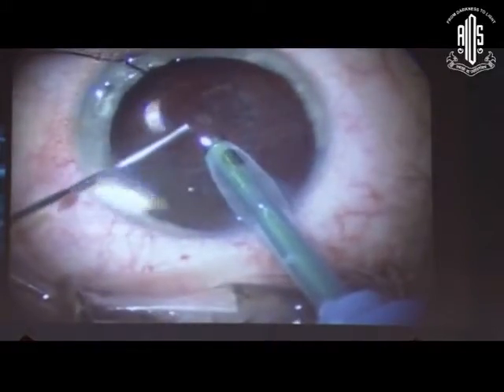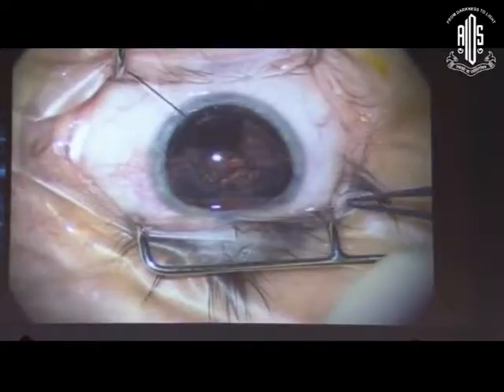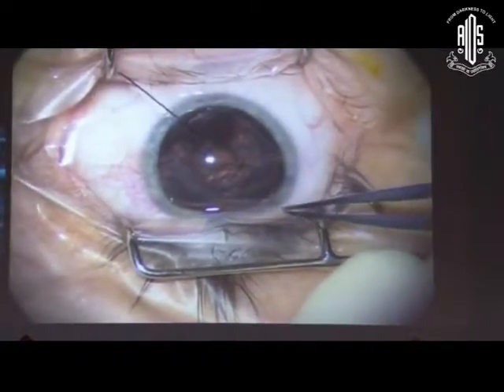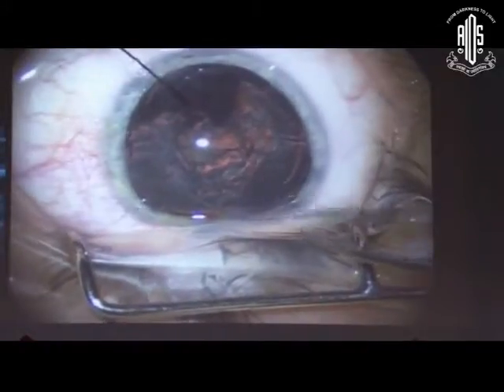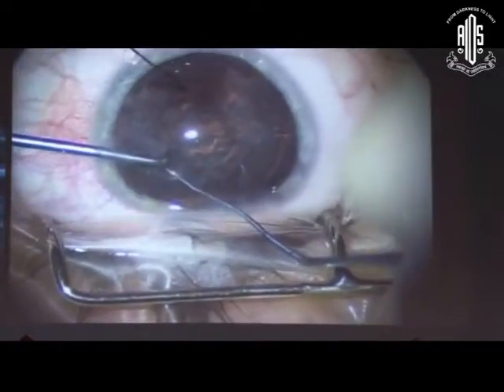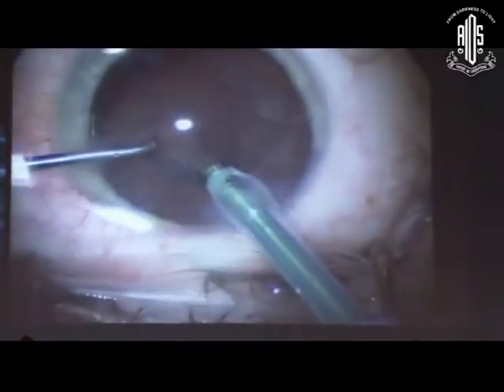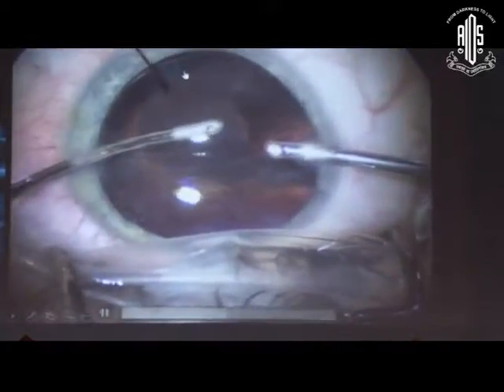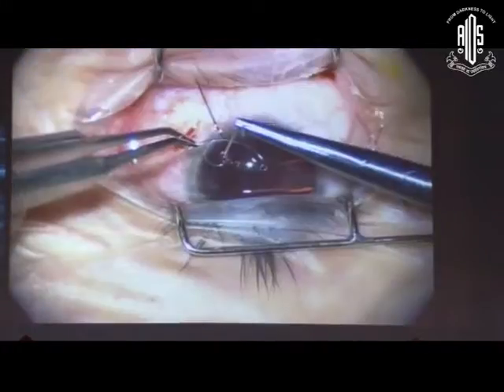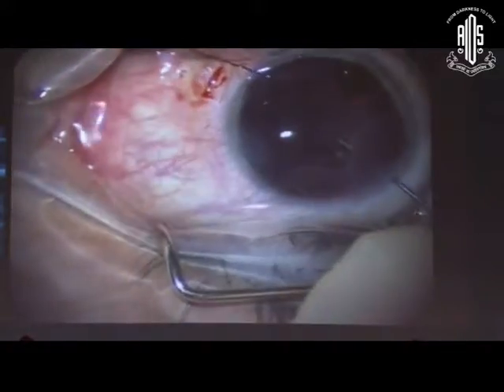There must have been something preoperative, because I'm being very gentle here. Zonular loss is not uncommon. In my practice, the most common reason is that it was preexisting but you didn't find it on slit lamp examination because it's not always obvious. At that point, I put in my CTR — because as you empty the bag, it becomes floppy and will come into your phaco probe, so you need to stretch and support the bag. I'm not worried about leaving cortical matter; I can clean it around the CTR. The thing to notice is that the CTR is visible around the edge, which means it's not going to be enough — a perfectly centered bag should have the CTR under the iris, not visible.